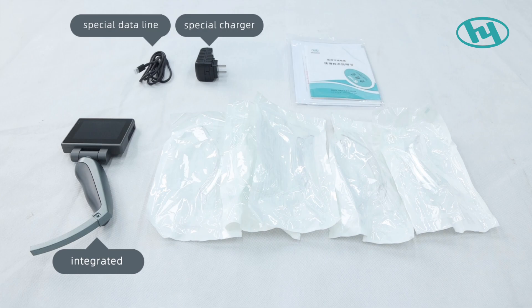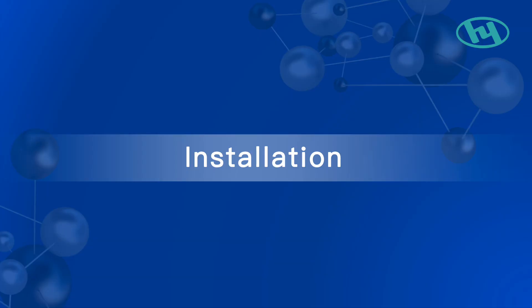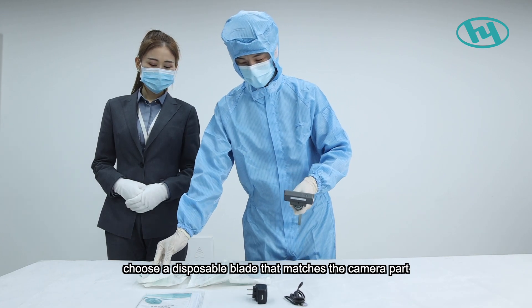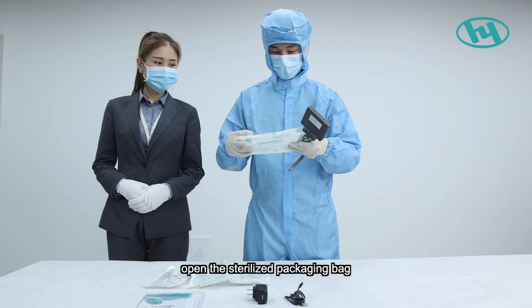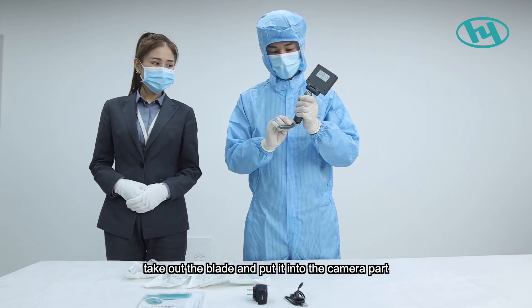Five, single-use laryngoscope blades; six, operating manual. For installation, first pick up the main unit and choose a disposable blade that matches the camera part. Open the sterilized packaging bag, take out the blade, and put it into the camera part.